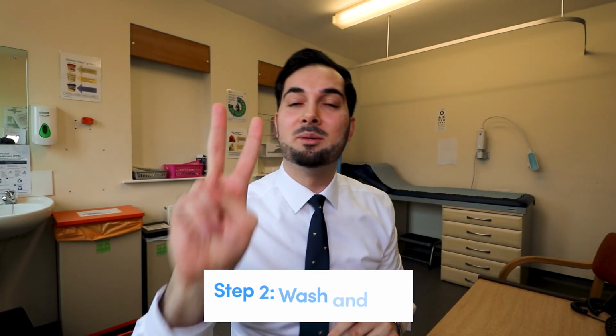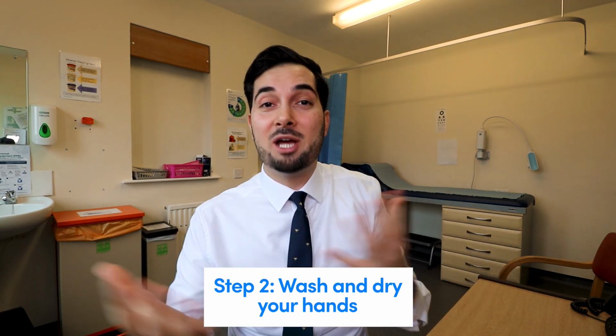Okay, so moving on to step number 2, the next thing you do is you need to wash your hands. Wash your hands with some soap and water, so again, they're nice and clean and it's not going to contaminate anything.